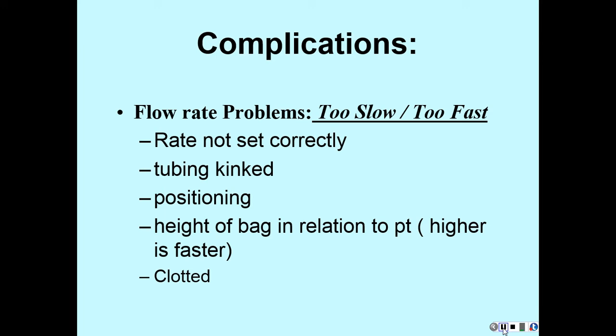Okay? Keep in mind, though, if you have a clotted off IV, that you do not want to irrigate that cannula, because what can happen? What happens if it's clotted off and you start trying to force something through there? You throw out clots into the circulatory system, right? Then you've got an embolus going on out there. Not good, not good. So you never want to forcefully irrigate an IV catheter.